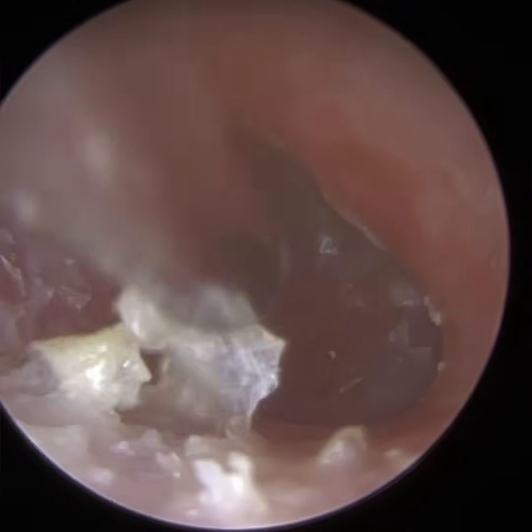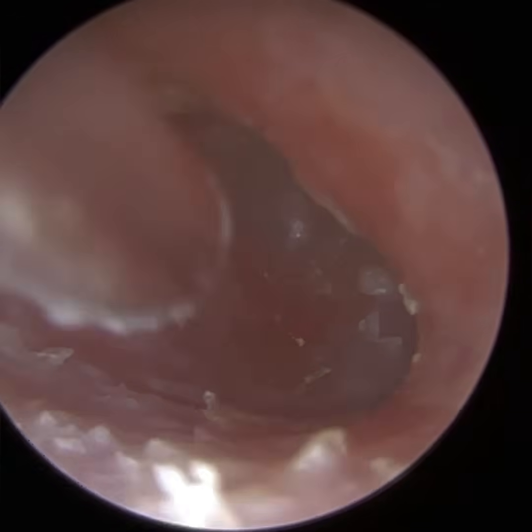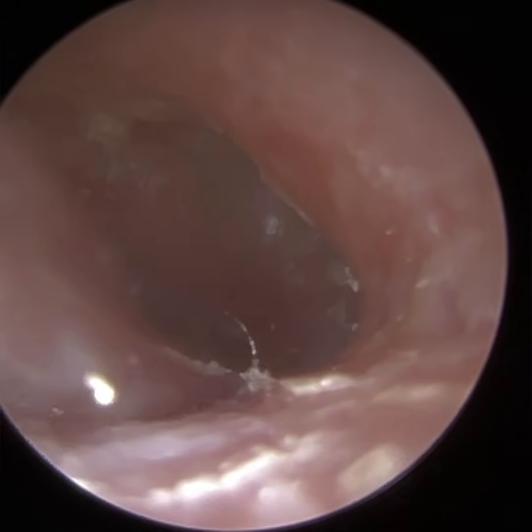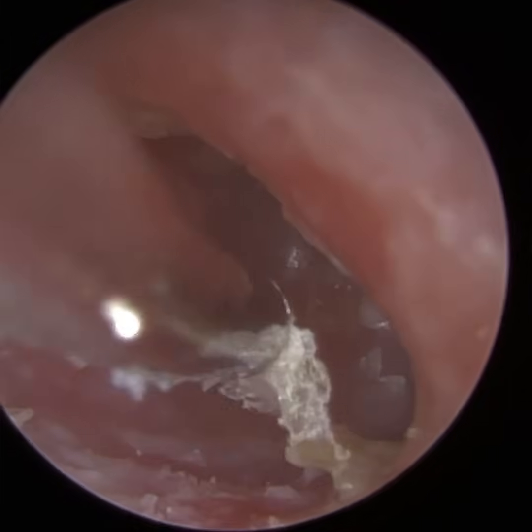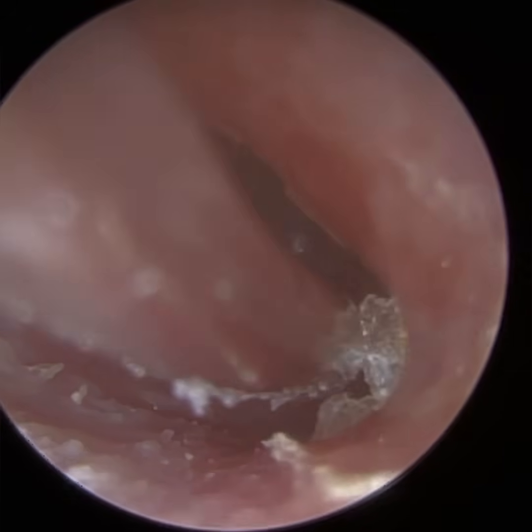It's not always possible though, because of course they're attending with an infection, so the ear's going to be tender, it's going to be a bit painful, so you just have to judge it. Obviously patients have different tolerances, some patients are more sensitive than others, so you've got to think about the ear anatomically, but also the patient and how they respond to you performing the procedure.